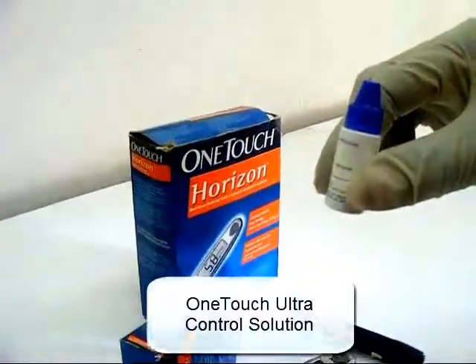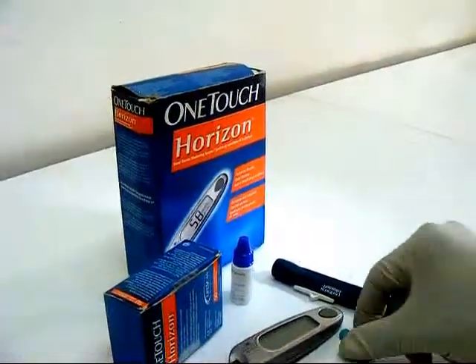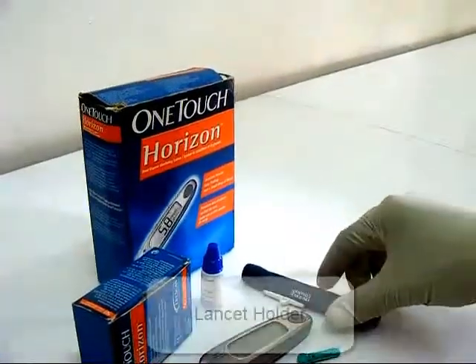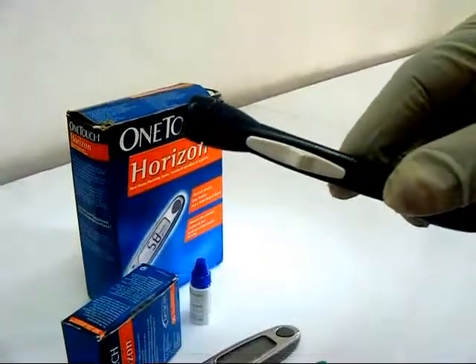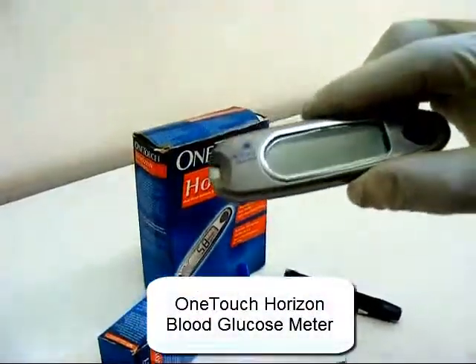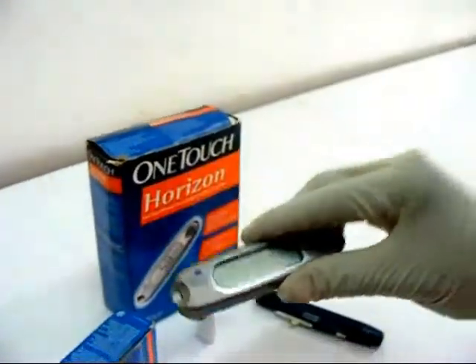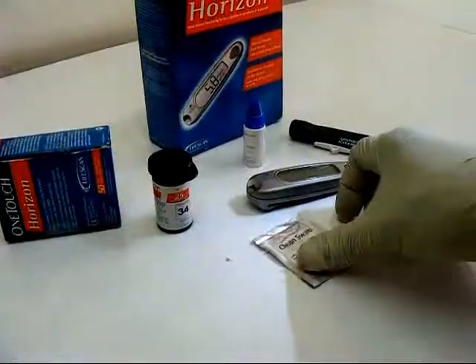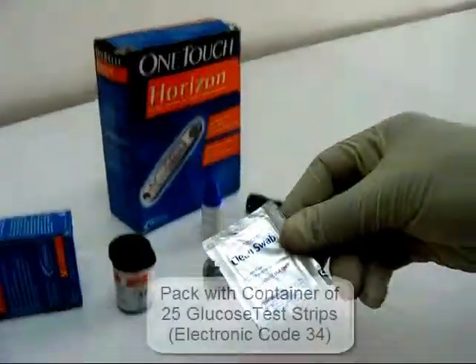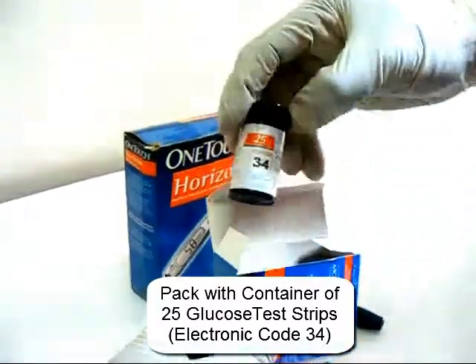The OneTouch glucose monitoring kit consists of a OneTouch Ultra control solution, a lancet, and a pack which has a container with 25 glucose test strips of electronic code 34.